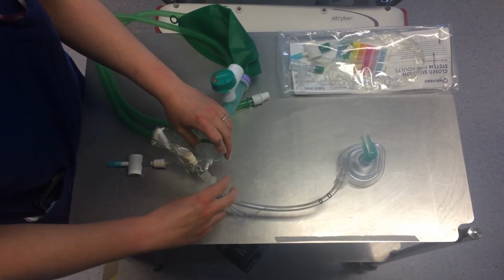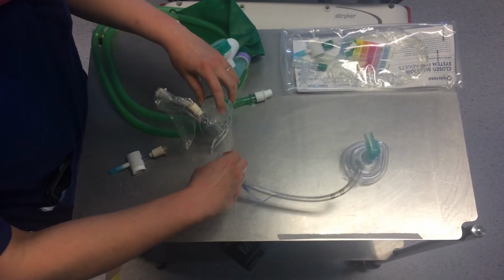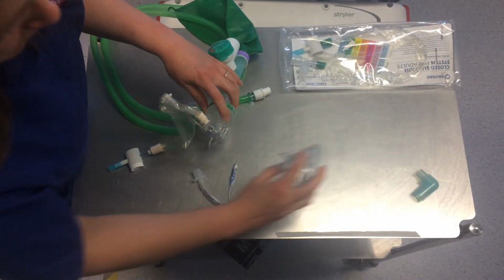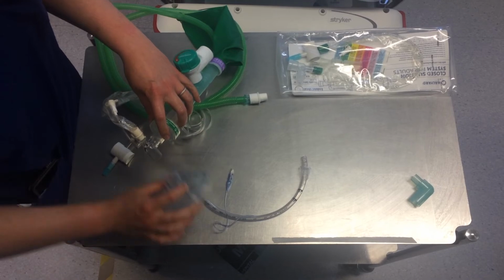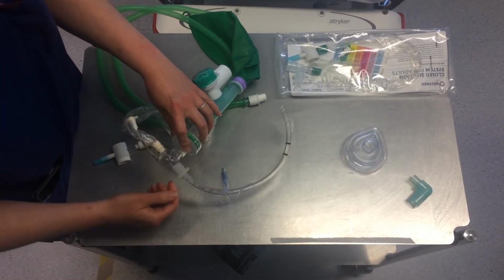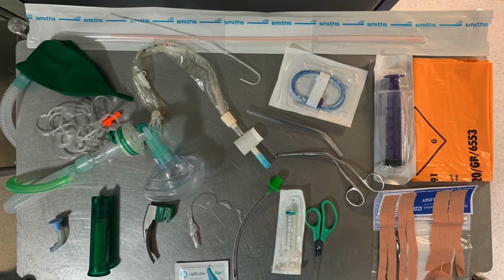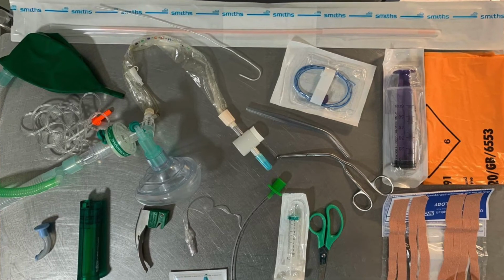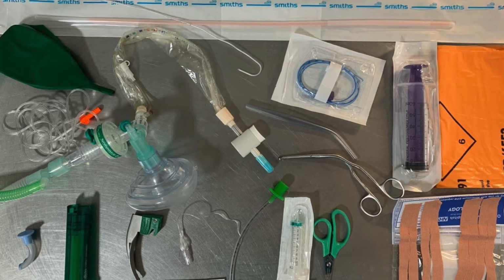If you're using the larger inline suction that fits directly onto the mask, you wouldn't have this there, it would be connected like that for pre-oxygenation, and then you would remove the mask and put that straight onto the endotracheal tube. Remember, the airway sequence is in alphabetical order: circuit, end-tidal, HME filter, inline suction, and then mask or tube.